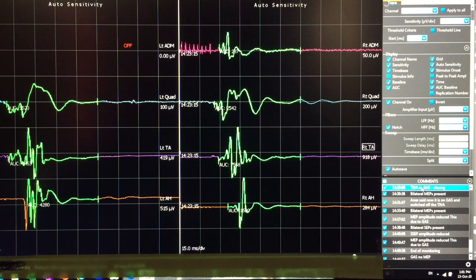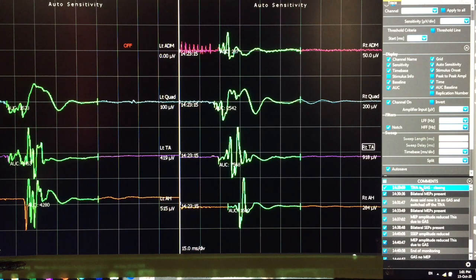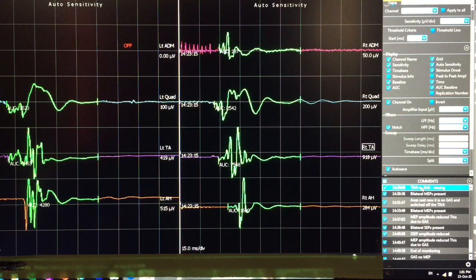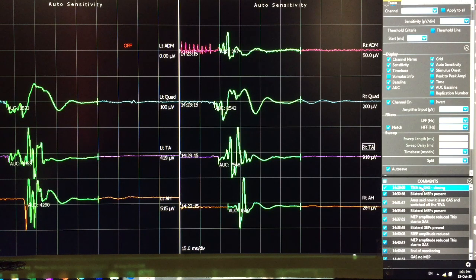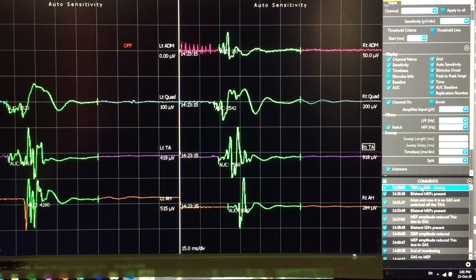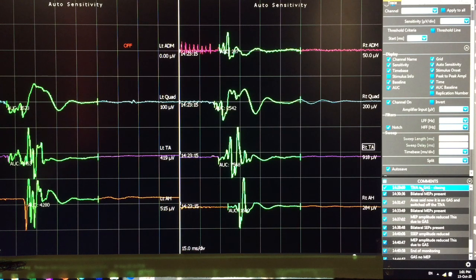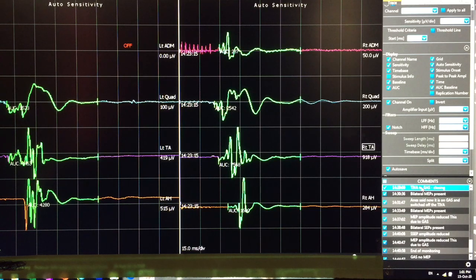In this video, I am going to show how and how quick MEP, that is motor evoked potentials amplitude, will affect if TIVA is switched and put the patient on gas inhalation anesthesia.